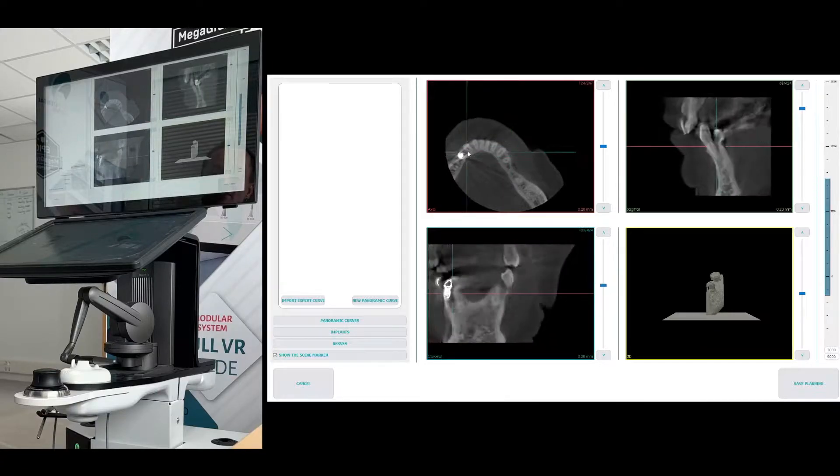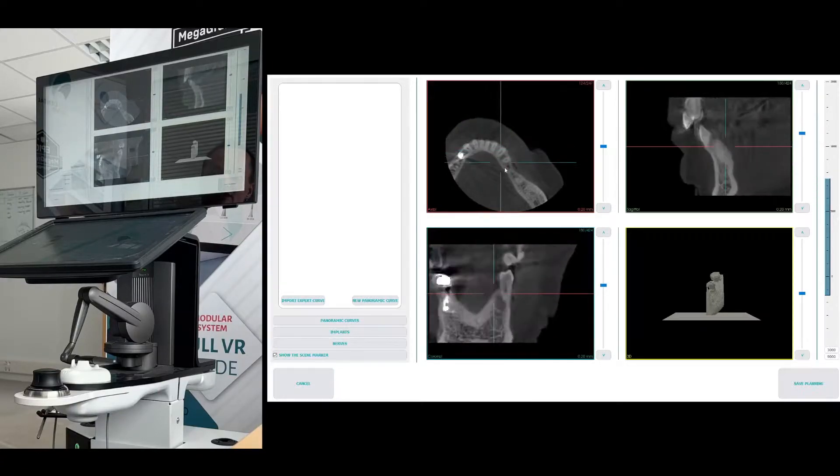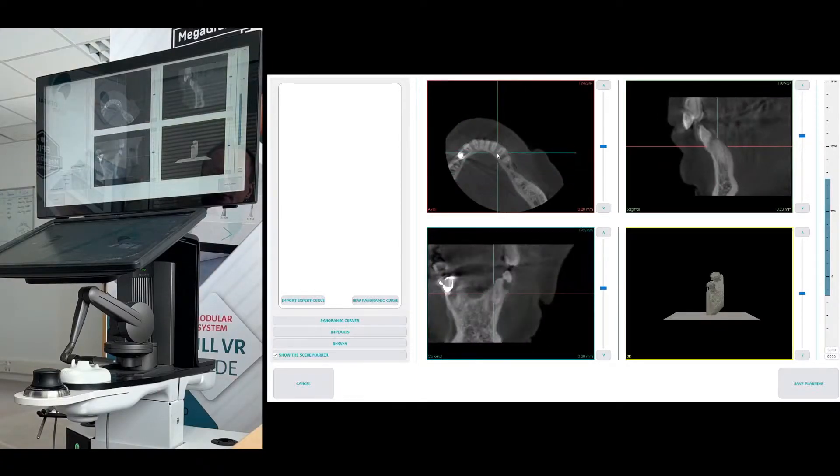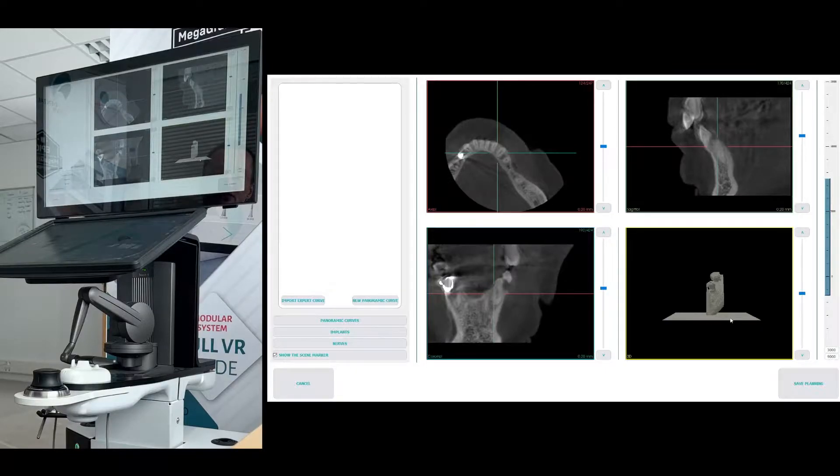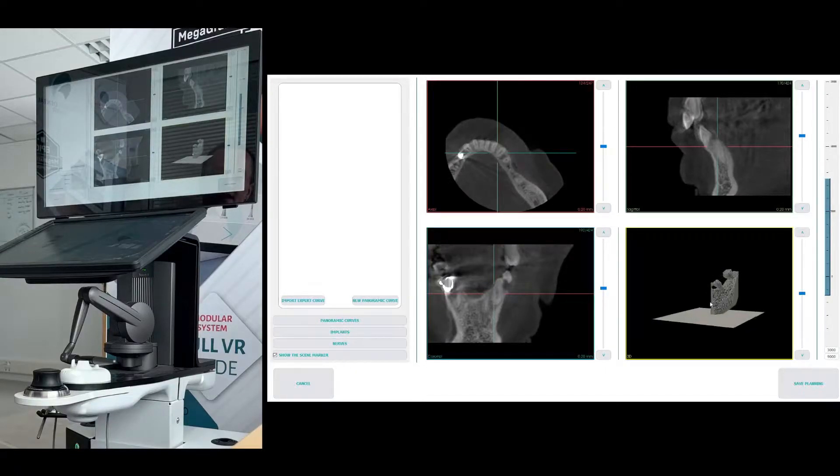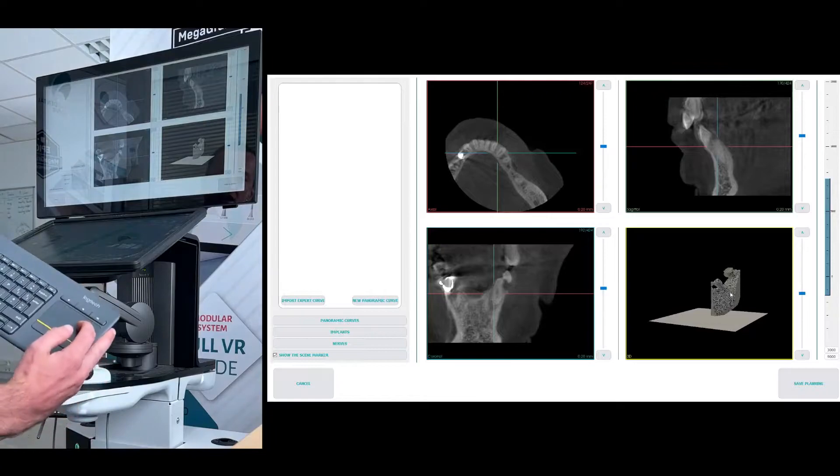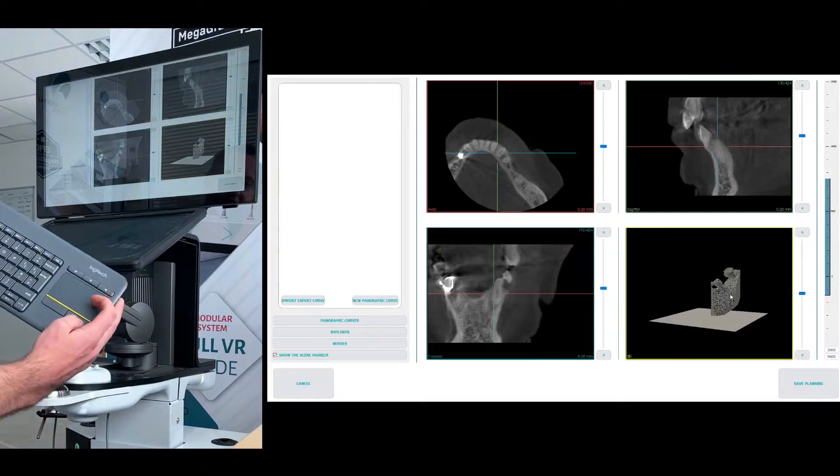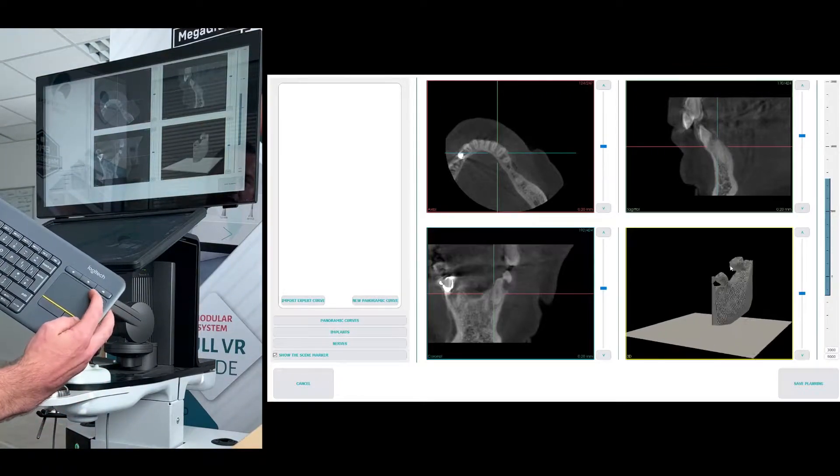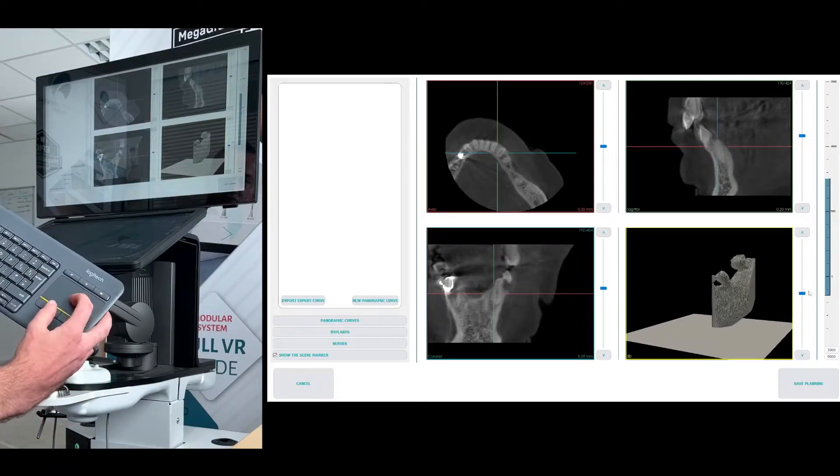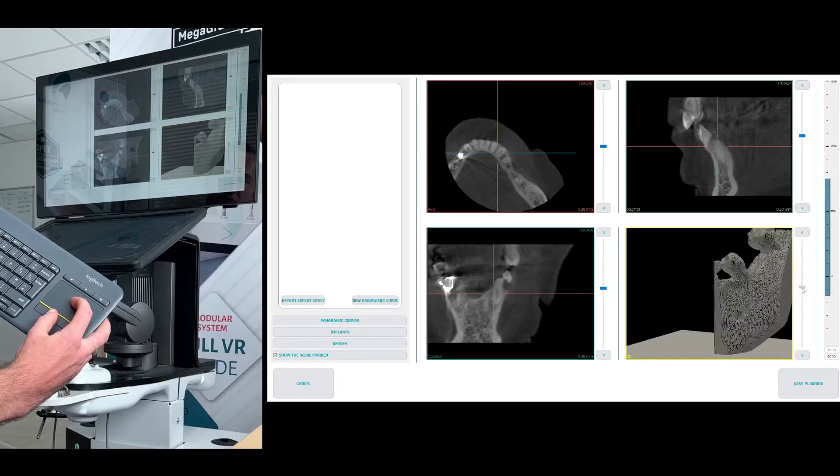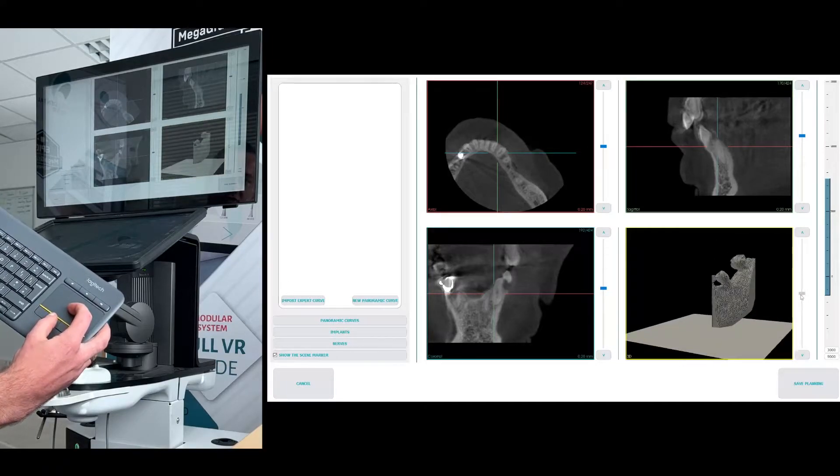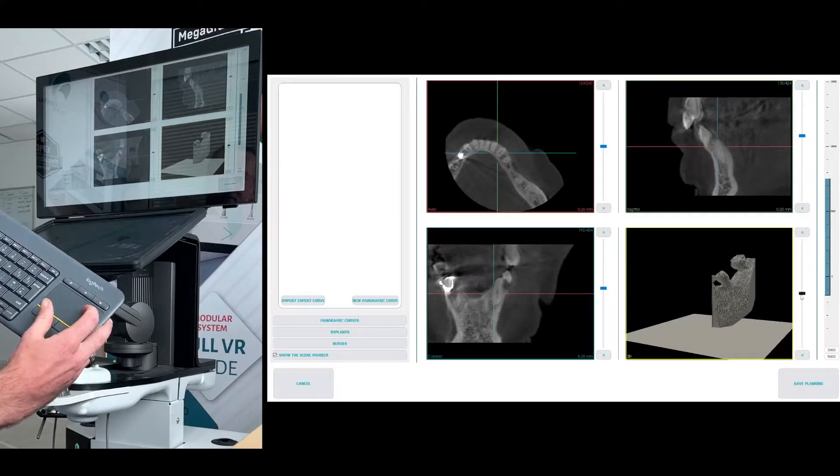You'll see the DICOM scans loaded from this patient. We have the three different views as well as the 3D image in the bottom right. If I right click and slide up, I can then zoom in on this one as well. I can also use the slider if I prefer.